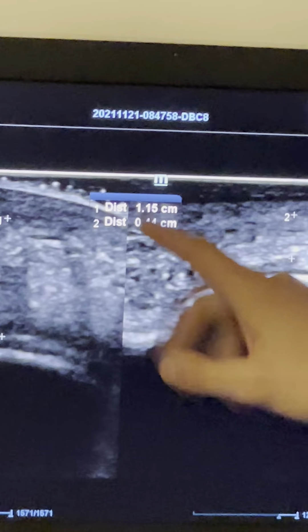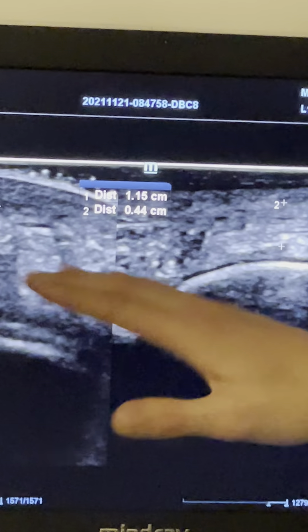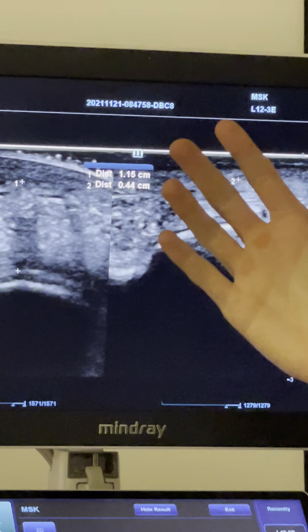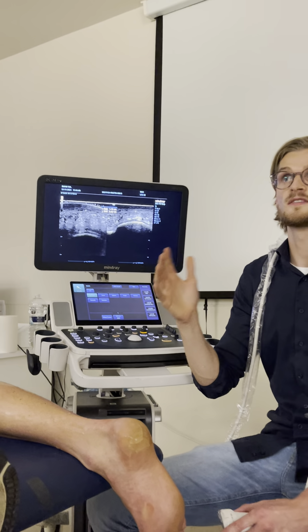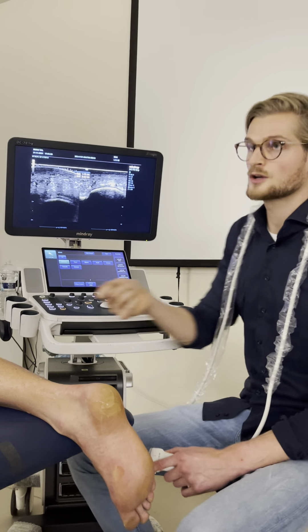So now the fat pad index is 0.44 and then 1.15, so it's somewhere around 40% — a 40% fat pad index. A normal fat pad index should be around 50%, and the lower the index, the more you can compress the fat pad and the more it can potentially irritate structures around the calcaneus.